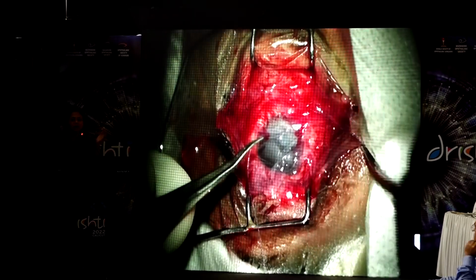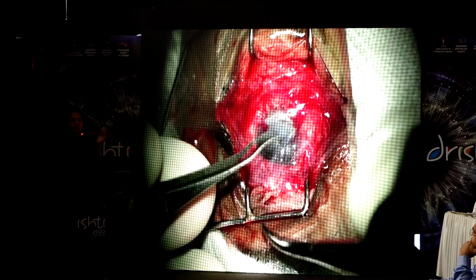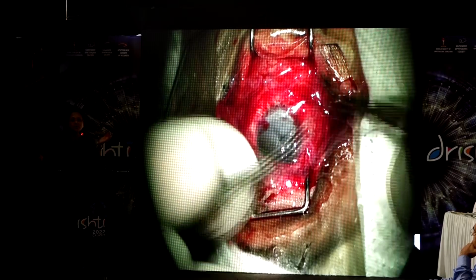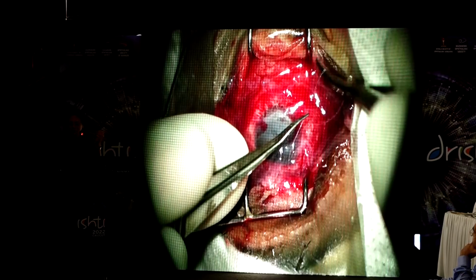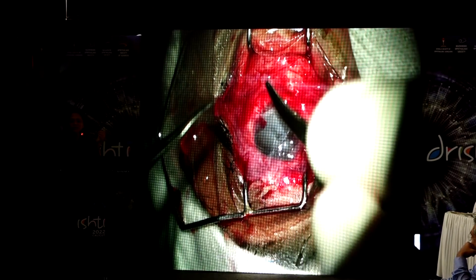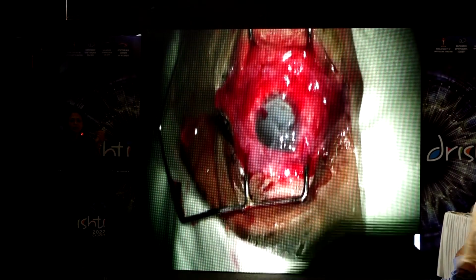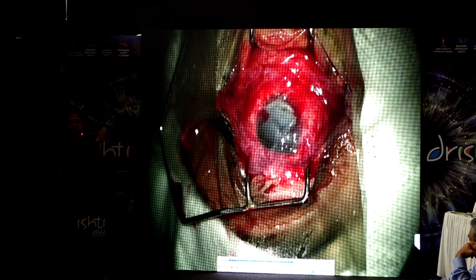Remember, when you're suturing amniotic membrane tissue, do not put in radial sutures. If you put radial sutures, the sutures will cut through your amniotic membrane, and the very first day post-op you will find the membrane is hanging loose, and then you will have to take the patient back to the OR, and that sometimes is quite embarrassing. So I always follow the technique of putting circumferential sutures. You can also put continuous circumferential sutures or continuous knotted sutures, mattress sutures, like as you would do in a trap surgery for better fixation, in case it's a large area to be done.